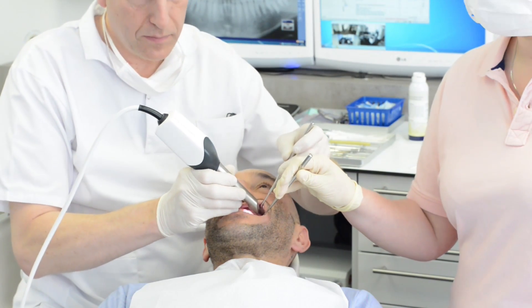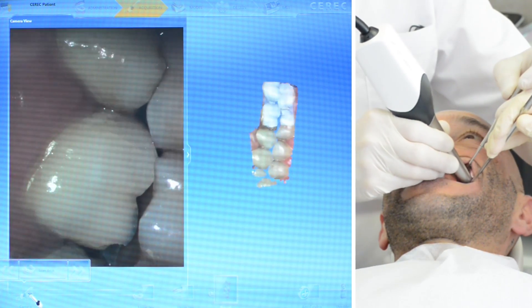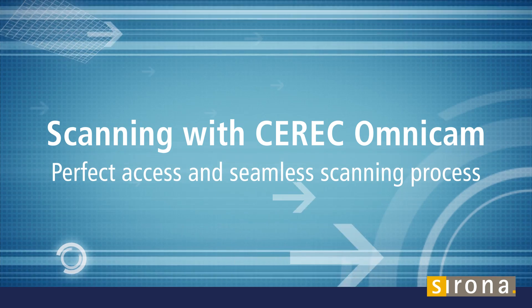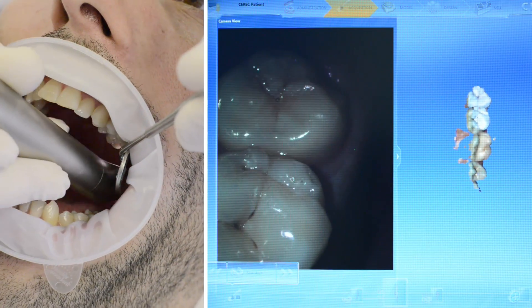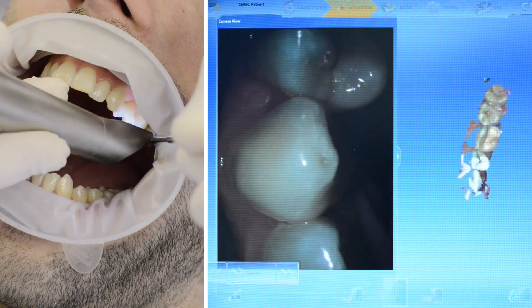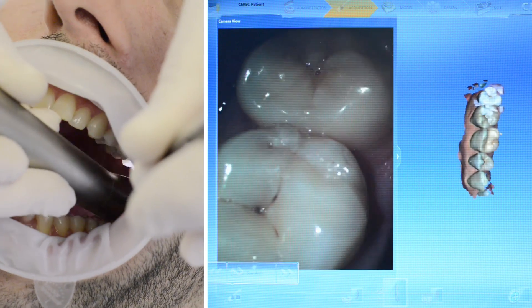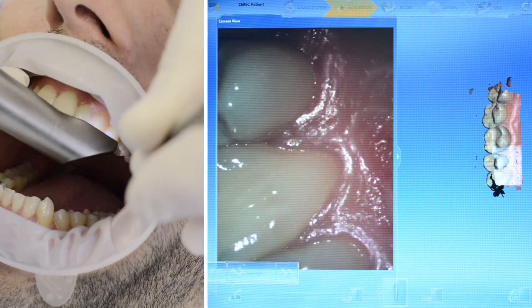The OmniCam requires no powder and is optimized for scanning natural tooth structures and gingiva, resulting in precise 3D scans in natural color. With OmniCam, both jaws can be optionally scanned before preparation, and the prepped teeth can be added to the virtual model later. The OmniCam has a small head which allows easy access to the posterior teeth, and the user simply moves the camera head closely over the teeth in a single flowing movement.